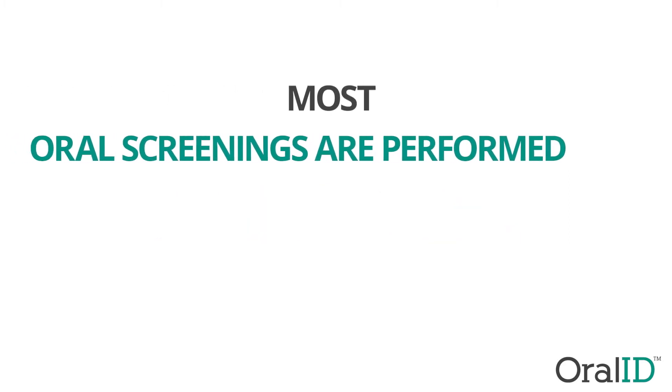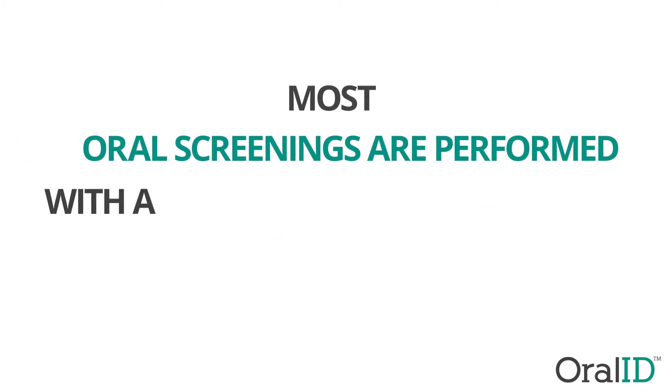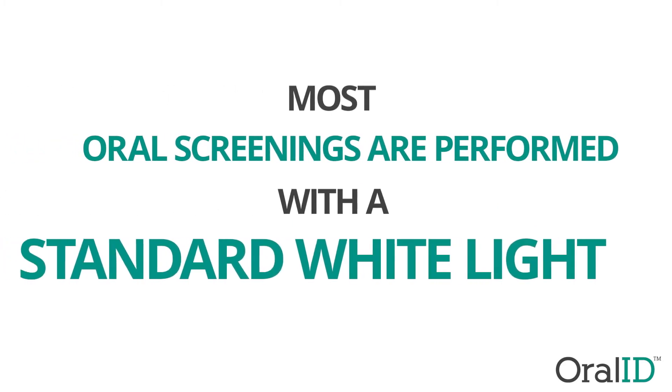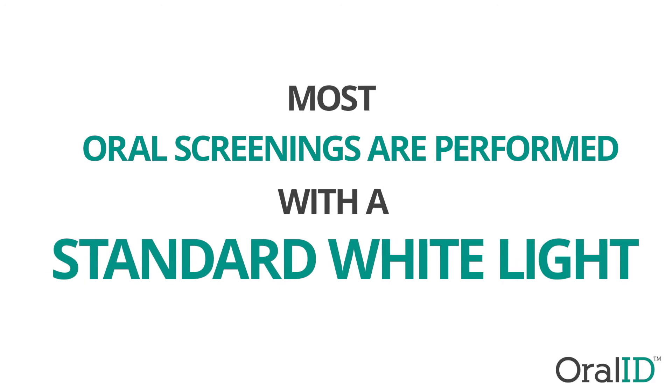Most oral screenings are performed with a standard white light, which can make it difficult to detect early stage cancers.